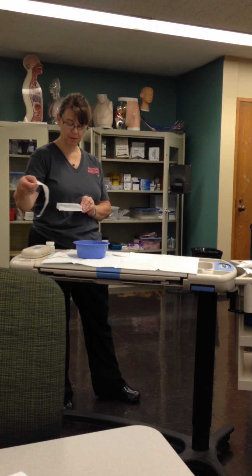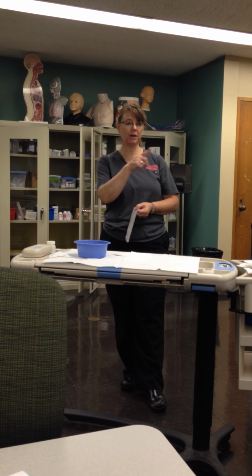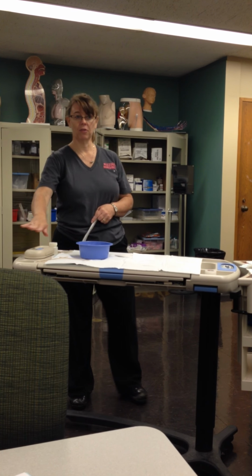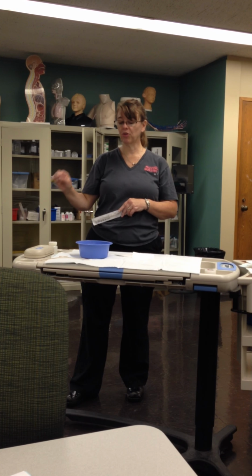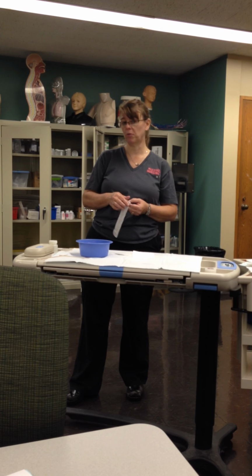the side, but see, I got one on, one off. If you can undo them, and this is what I was talking about, Kayla, when you smiled, and I said, you people with OCD and your cleanliness, you're gonna wanna reach and get that. Leave it. Just leave it and throw it away when you're done. Because you're more likely to contaminate, accidentally touch, or reach over something if you try to get it off than if you just leave it and throw it away at the end.